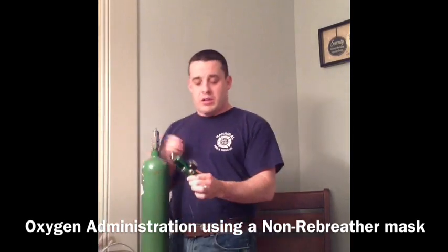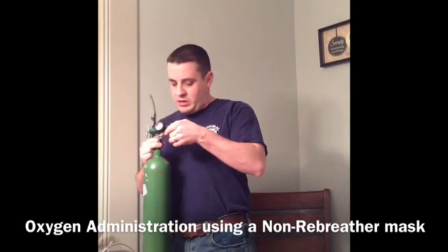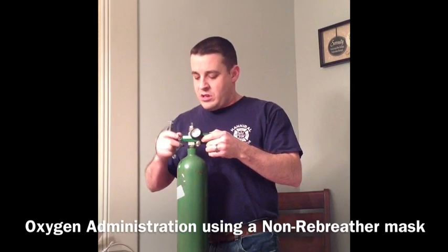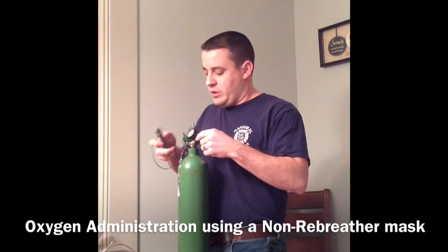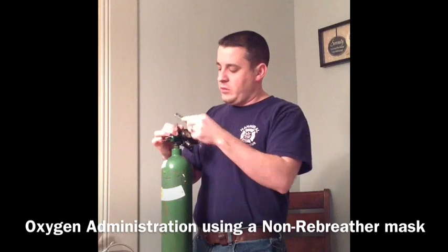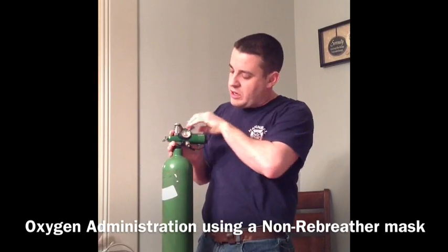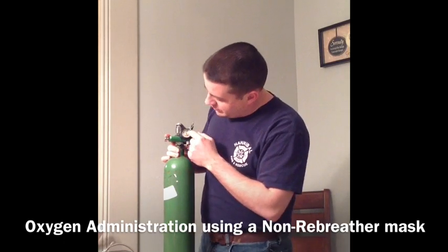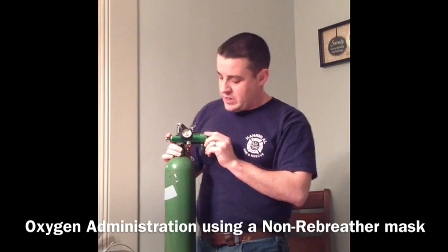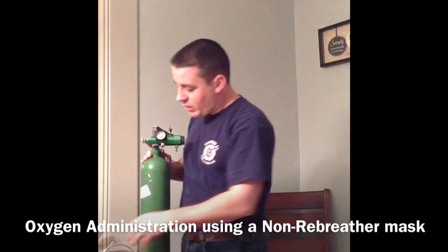First thing we're going to do is apply our regulator to our bottle. There's only one way that it'll go on there, and we'll just go ahead and slide that right on, fit it right in, and tighten it down. Once we get it tightened on there, we'll use our O2 wrench and just give it a little snug so it doesn't leak. Then we're going to turn our bottle on, give it just a little crank, and make sure that we don't hear any oxygen coming out or leaking. Check our valve to make sure that our needle is in the green or above the red.